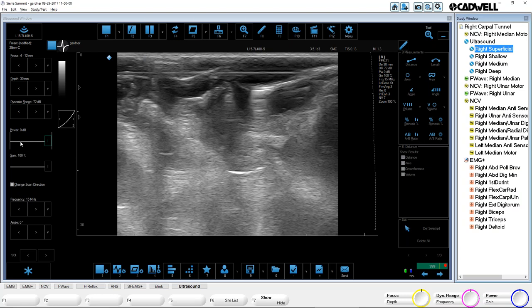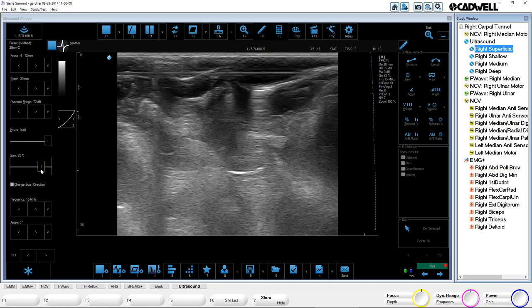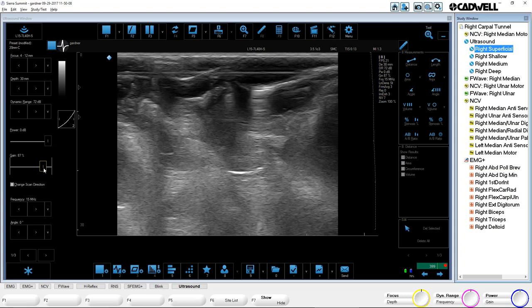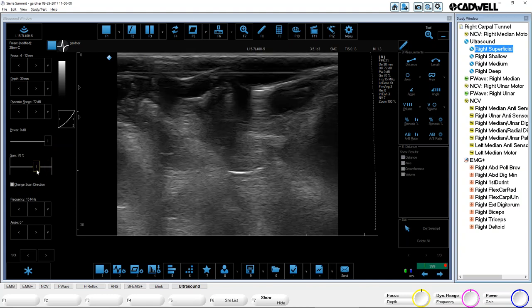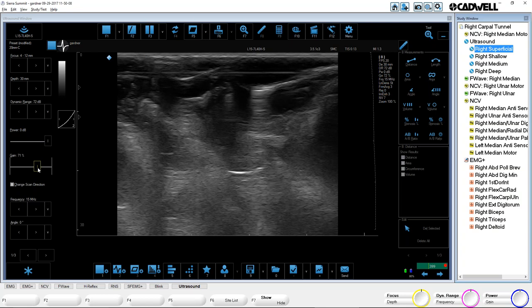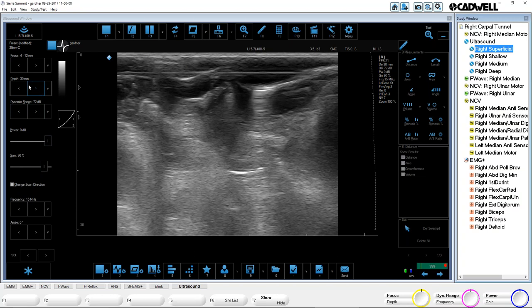Power and gain — power is how loud that probe is screaming. We're using sound waves, so that's the power of your voice — I usually keep that all the way up. Gain is your sensitivity of how you're listening. I don't keep gain all the way up typically because it's usually too bright and you see too much reflection. Gain you'll usually adjust somewhere between 60 up to 100, depending on what you're looking at. The two modes I adjust the most are usually gain the most, and then dynamic range slightly to get the right contrast. Power I don't adjust, and depth I don't adjust unless I need to go deeper. Focal points just depend on how clear you want the image.